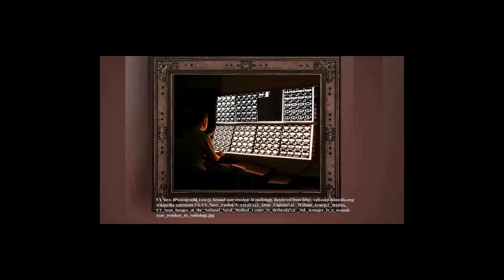Regular x-ray, we had cassettes that we actually put a film in, similar to film in your cameras. Kind of like an old school Polaroid. Right. No, a Polaroid would be more like the daylight processor kind. This was like film; if you opened the little carriage, it would expose it to light. So we had big film that would go into cassettes, depending on what body size you're imaging. For a cervical spine, you have 5 different images. That would be 5 different pieces of film that you had to run and develop. And you had to go and hang them on a view box for the radiologist to read.